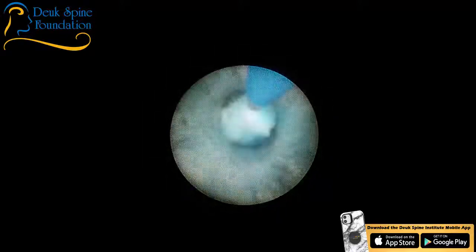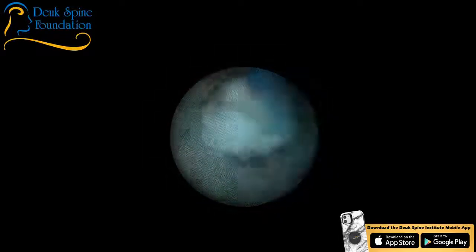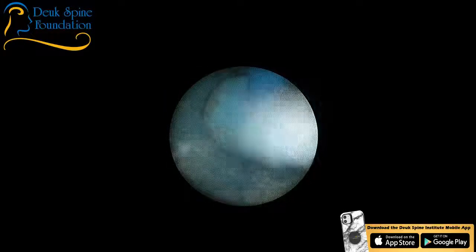These are all fragments of disc. Remember, this is C6-7. So this is the bottom disc that we're fixing. Look at, there's a big herniation right there. You see that? Right there. Let's try to grab it out.